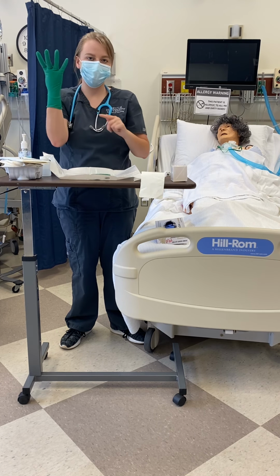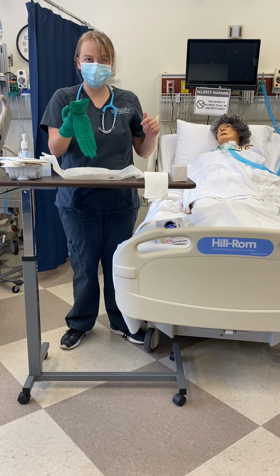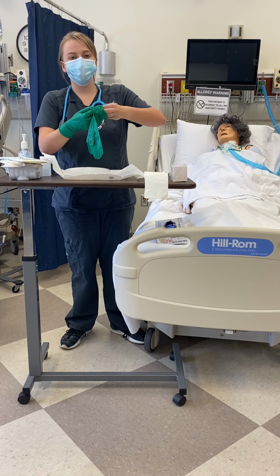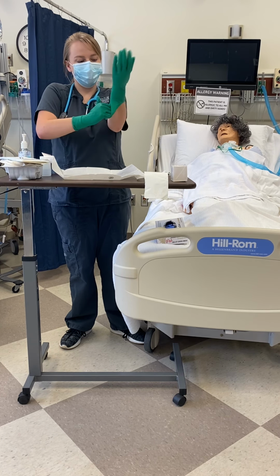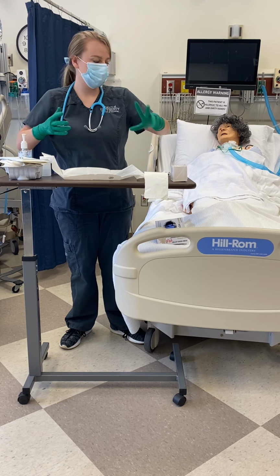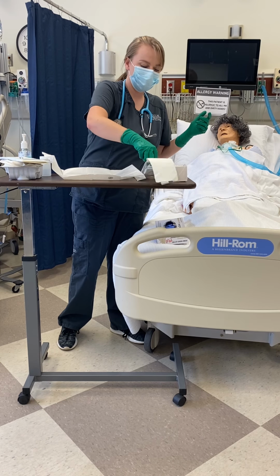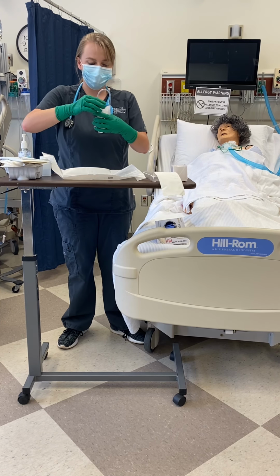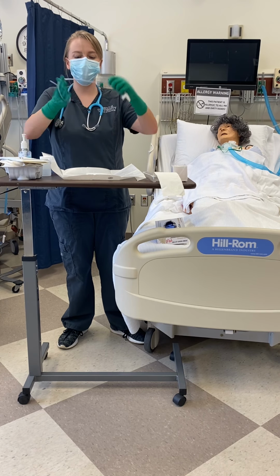And my glove just rolled, so in the hospital setting, I would go ahead and redo this, but for this, I am not. Same with this one, it just rolled. So I will take this into my dominant hand.